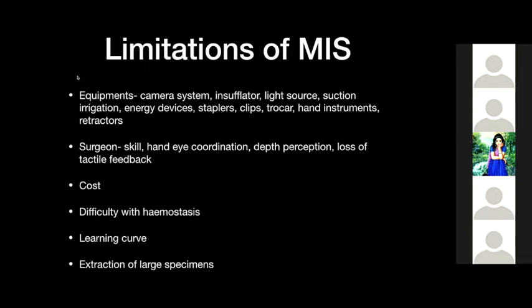Now, in terms of the surgeon, the moment you do a laparoscopic or MIS surgery, your skill set has to change. You see, you have to relearn hand-eye coordination. There is no more 3D perception. You are working with 2D. Okay, so depth perception and doing procedures inside the cavity may be a bit more difficult and takes time to master as compared to open surgery.